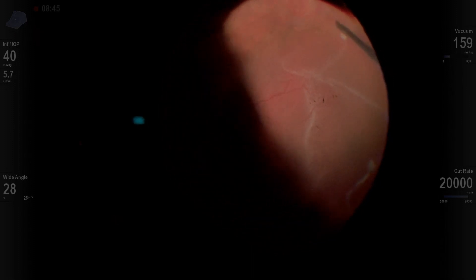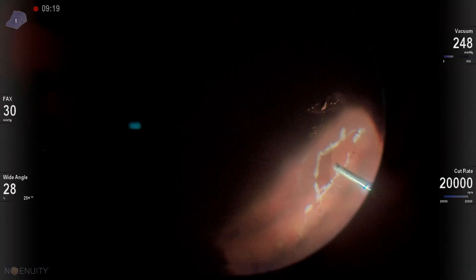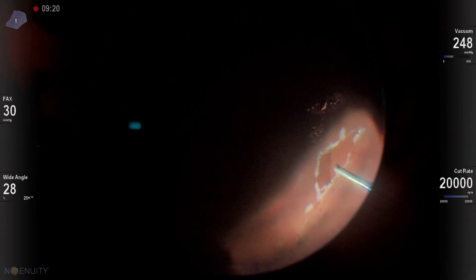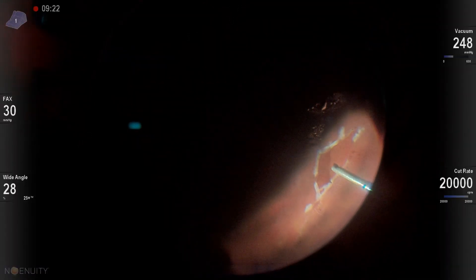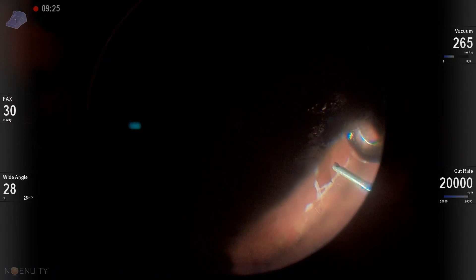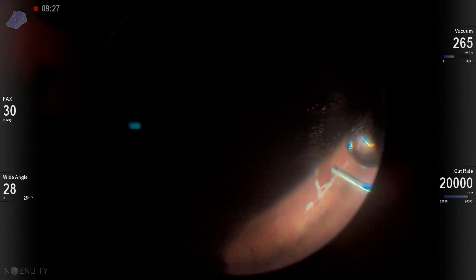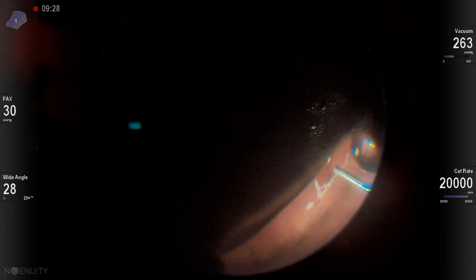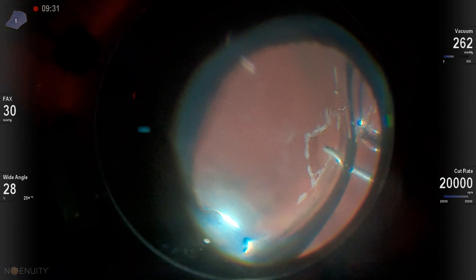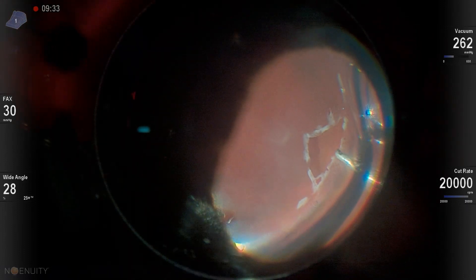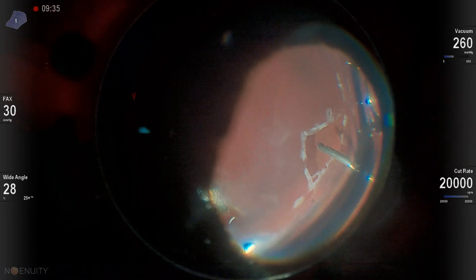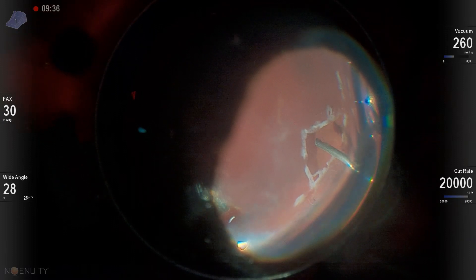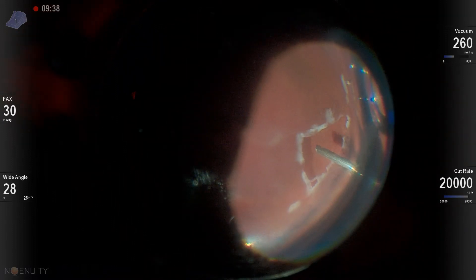Back in with the vitrector, still a little bit of vitreous remaining. And now I'm going to use my cutter as I go to air. And I like this if there's a lot of vitreous still left anterior to the tear. Because then you don't have that incarceration of vitreous into your soft tip. But that cutter is going to be able to remove that vitreous so you don't get that incarceration.